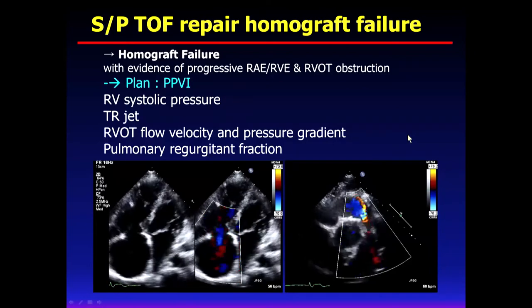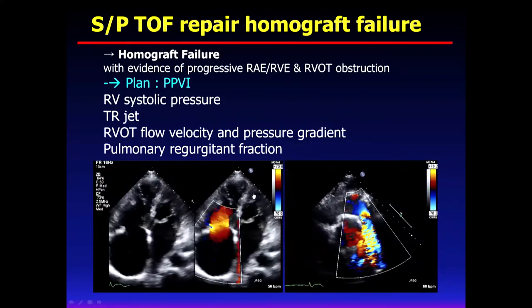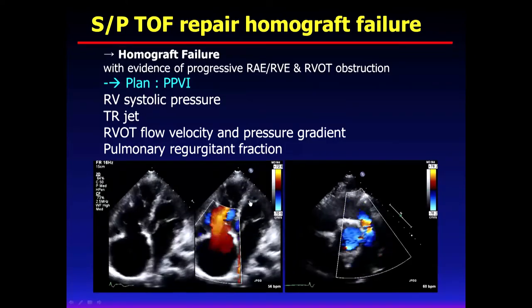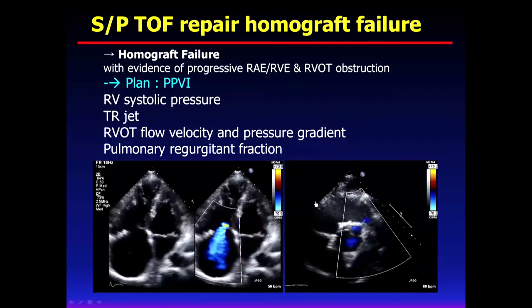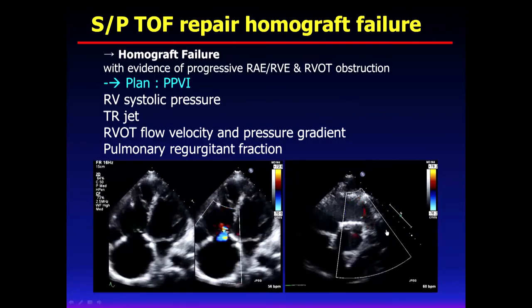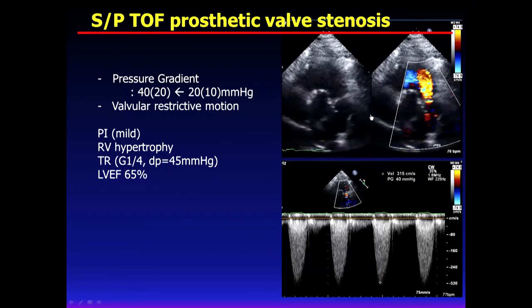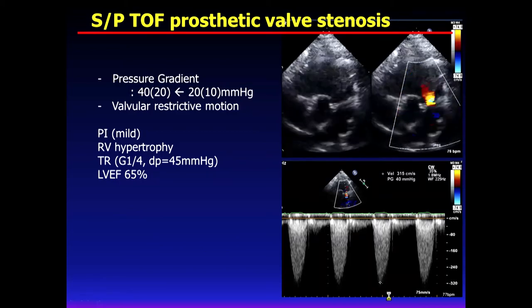And this is a homograft failure case. You can notice the big RA and RV, and the geometry changes a little bit. The LV apical geometry is deviated, with the apex formed more by the RV than the LV apex, which means the RV is getting bigger and bigger. And for the pulmonary artery, there are some limitations of the flow, so stenosis and regurgitation happen at the same time. And this is a prosthetic valve stenosis case. The prosthetic valve is here, but the flow is limited a lot. And PI and PS are inside here.